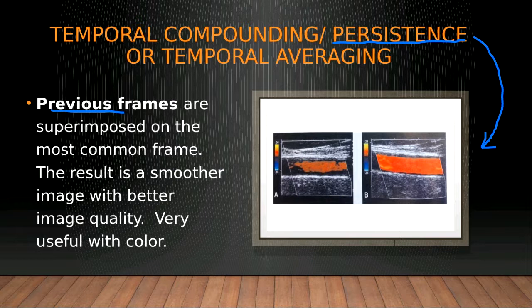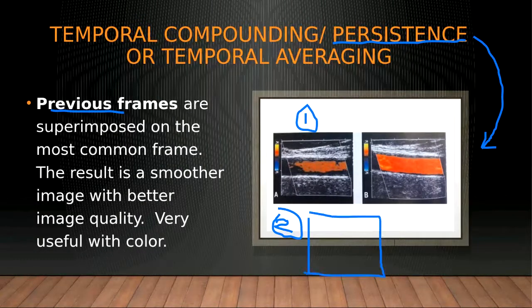If you look at this first frame here, this might be the result of one frame. Then you might have, let's say, a second frame, and it has a picture as well of the vessel. And let's say there's some color, but now the color is filling in more around these locations that weren't done on the first frame.